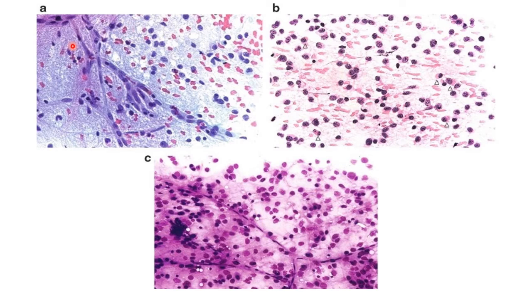So what you can see here is the fine capillary network that is typically associated with an oligodendroglioma, along with these round cells which lack the perinuclear halos. Besides these round cells, you can also see these cells. What are these? These cells have an eccentric nucleus and a dense pink cytoplasm, right? These are the gemistocytes or the mini gemistocytes. These mini gemistocytes are very characteristic of an oligodendroglioma. So besides that, you have a fine capillary network, some degree of calcification, round nucleus lacking a perinuclear halo, and some degree of gemistocytic change.